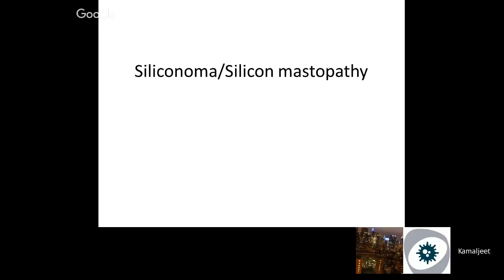Last one, silicone. Medullary is usually triple negative. But medullary is out of fashion because the idea is many of these are associated with BRCA. And when you have BRCA, you think of medullary, but they can be ER positive. So it's not black and white.